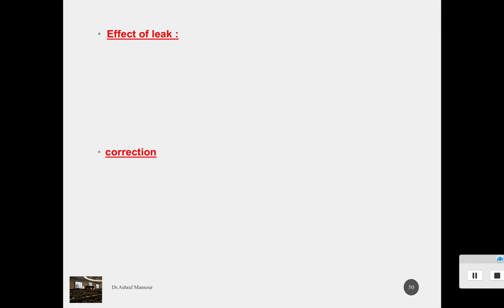So the ventilator will drive more pressure to get the volume which is needed. The more the pressure, the more the resistance, the more the leak. So again, there will be more leak, so more pressure, and at the end the baby will receive a lot of pressure. You don't know how much tidal volume is going during respiration.